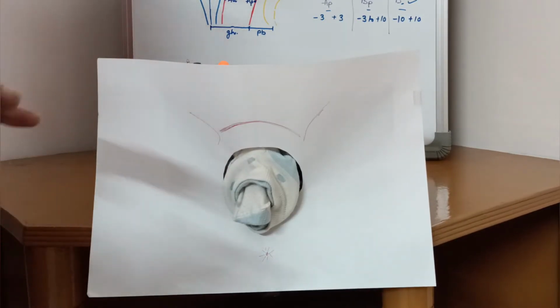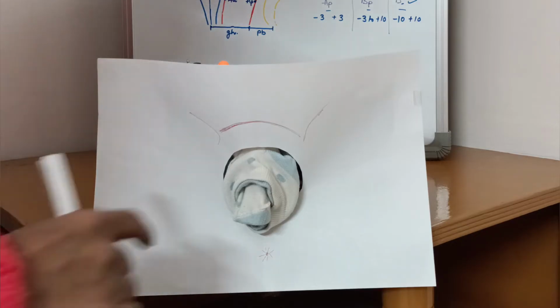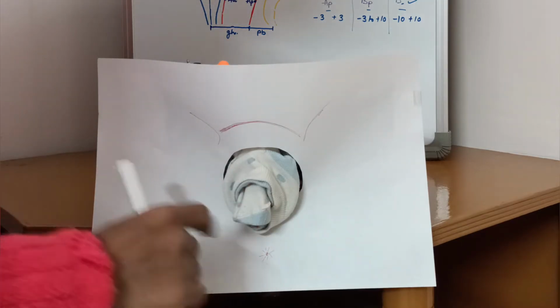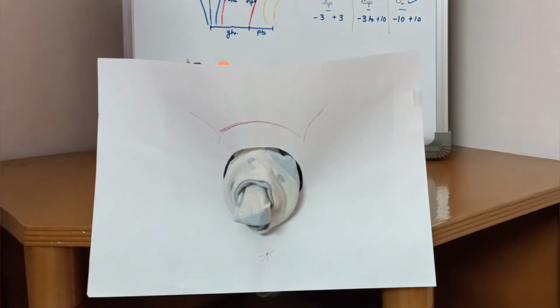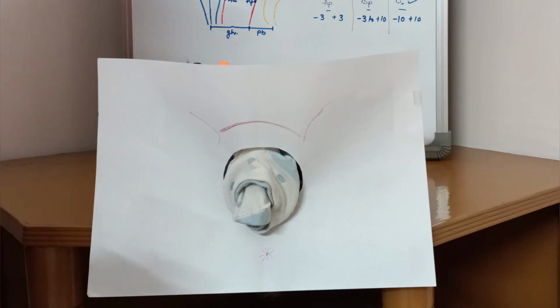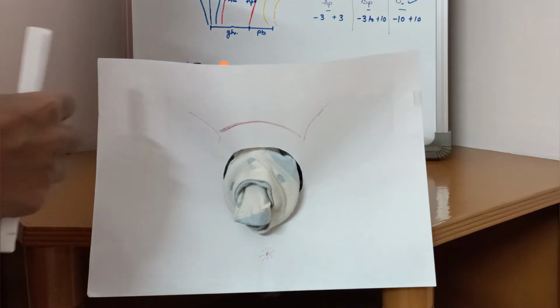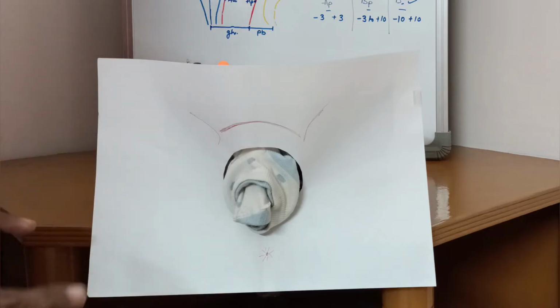Just to tell you the landmarks again, we have the labia majora and minora, this is the vaginal wall, and this blue part is our cervix. All the points that we are going to measure are taken on maximal straining or coughing of the patient, and then we reduce the prolapse and measure only one thing, that is the TVL, total vaginal length.